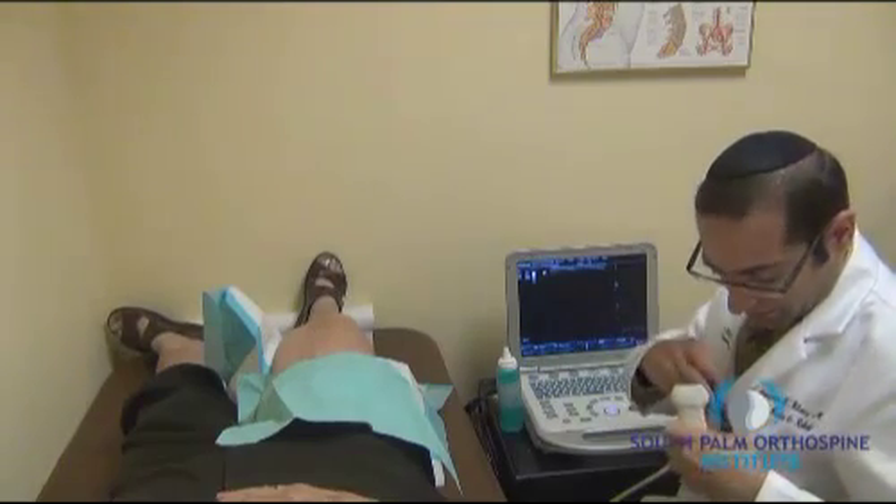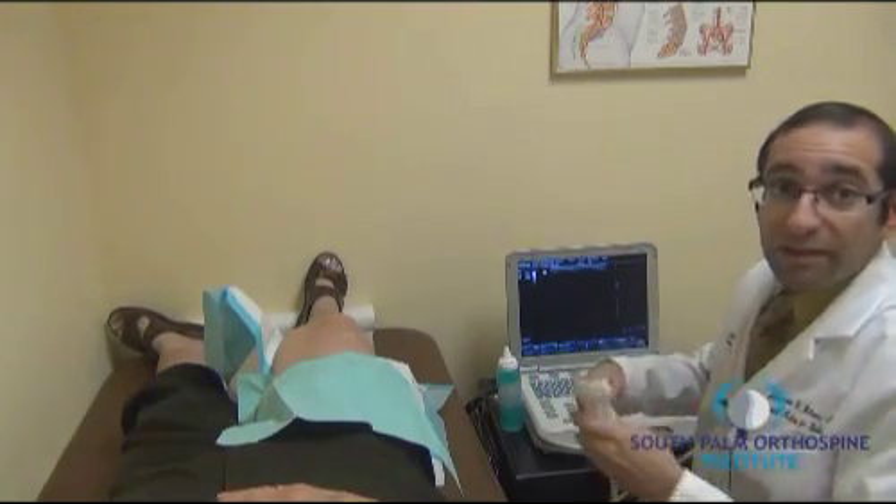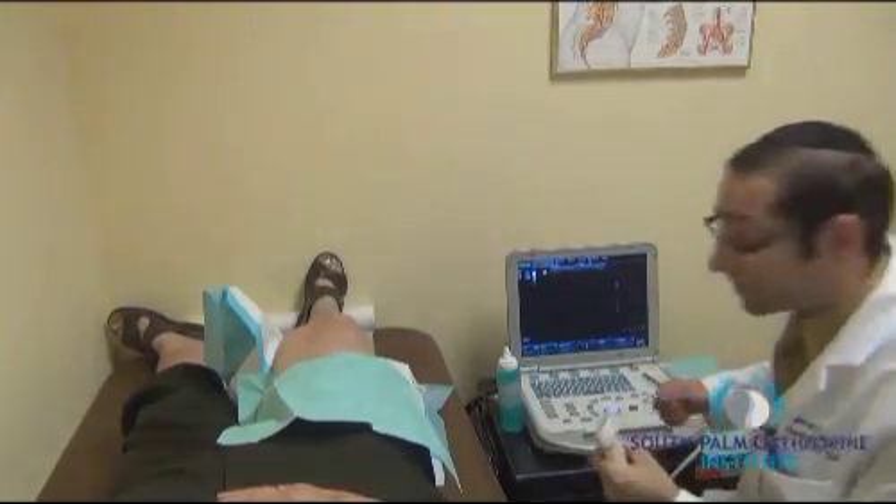The area is then marked and the knee will be prepped for the injection to be performed in a sterile fashion.